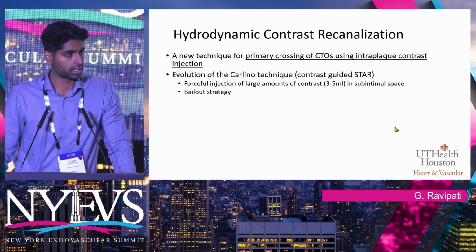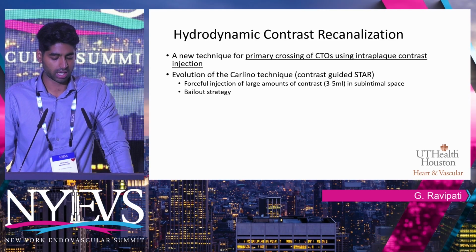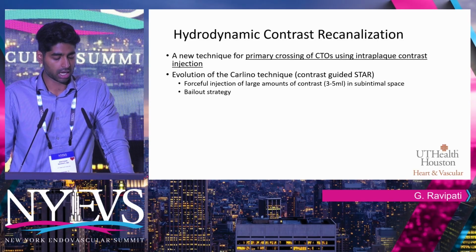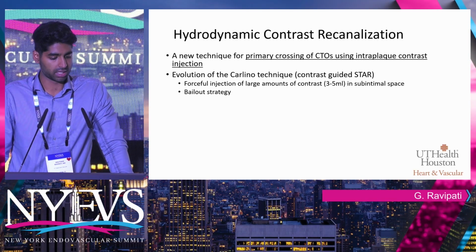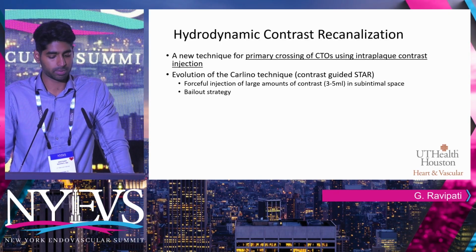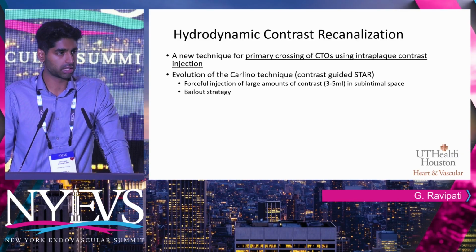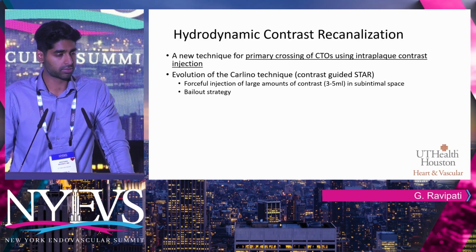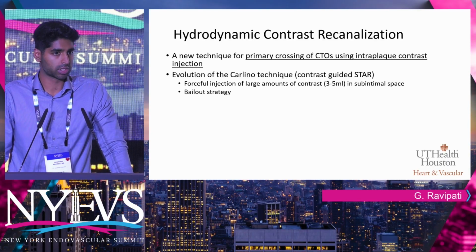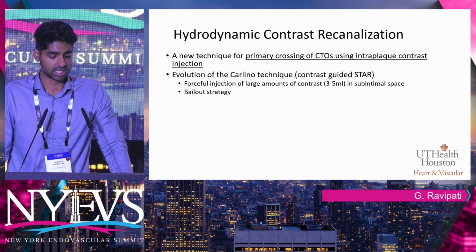So what is HDR? HDR is a new technique for primary crossing of CTOs using intraplaque contrast injection. It originates as essentially a new iteration of the Carlino technique, which was described back in around 2008 by Dr. Mauro Carlino. Essentially, it's a contrast-guided STAR. For those that are not familiar, it was developed as a bailout strategy when you're in the subintimal space to try and get back into the true lumen distally.